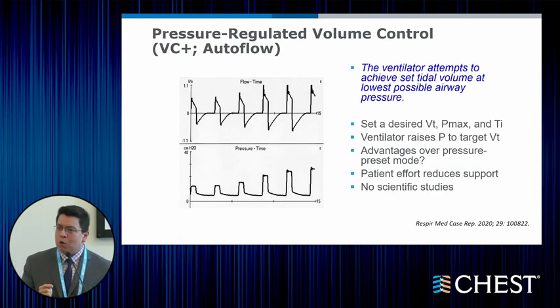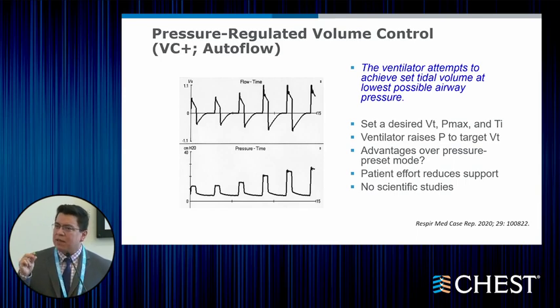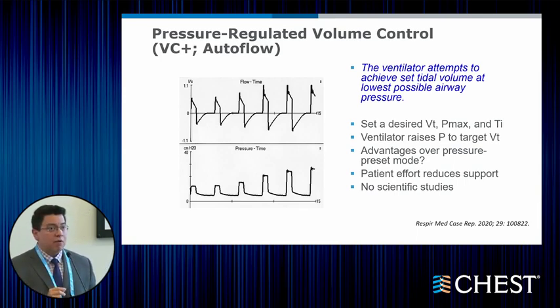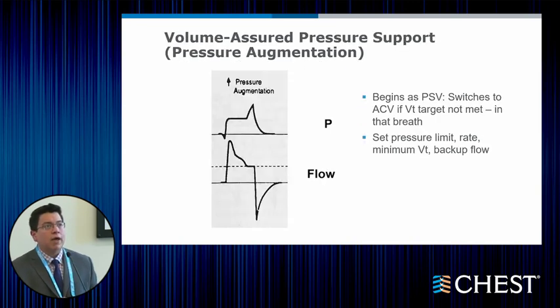So this is not a mode that can be used with patients who have very high respiratory drive and erratic breathing. It could be a good mode to train the muscles and for extubating patients, but again, there are no scientific studies proving a benefit over simple pressure support trials.